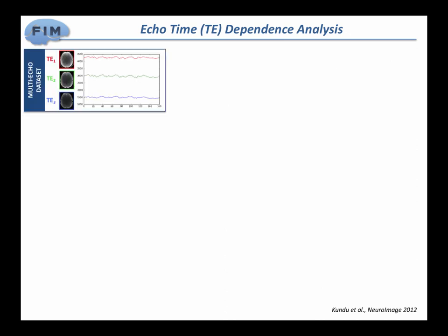So what can we do with this? Let's start thinking about some more interesting things. First of all, we need to have multi-echo data. If you have single echo data, this is just for fun, but you cannot apply these techniques. So the first thing you can do is start acquiring multi-echo data, which, as I said, I think buys you a lot. If you don't want all that it buys you, you can always use the middle echo as a first step to see what's in your data, and then take it forward from there.